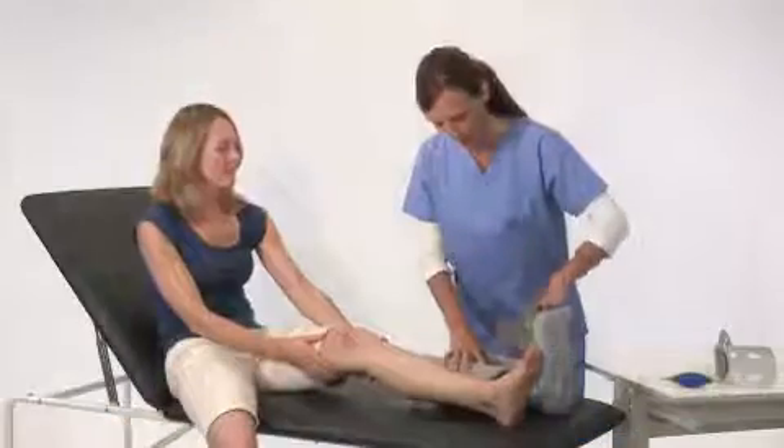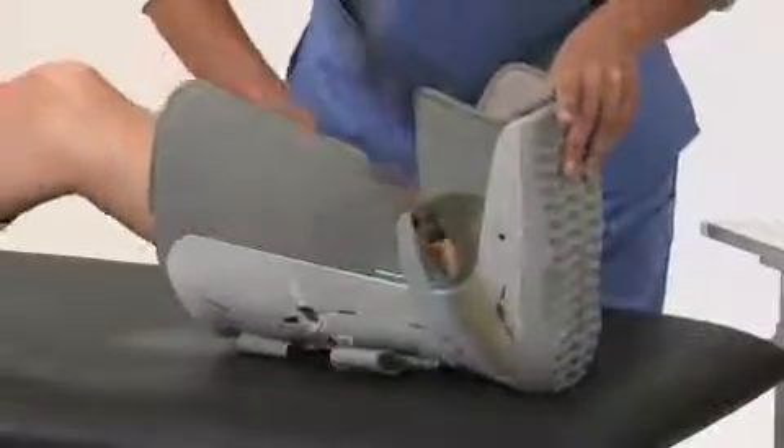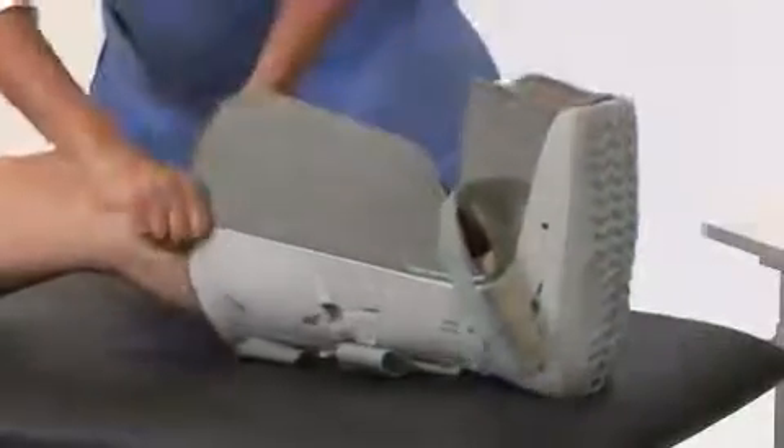While seated, place your leg in the brace and position your heel in the back of it. Pull the liner up to remove any wrinkles.